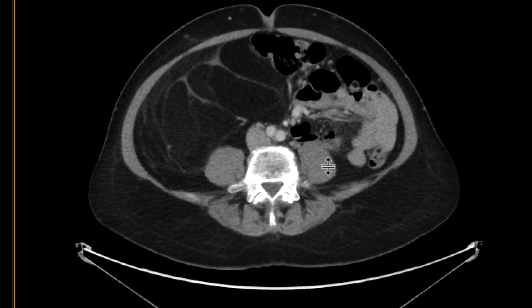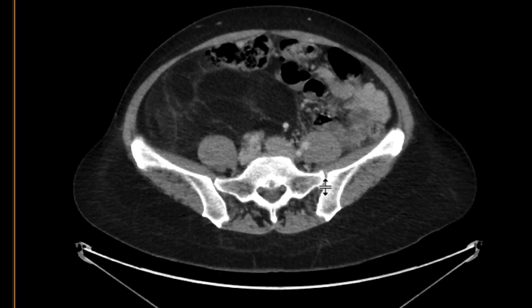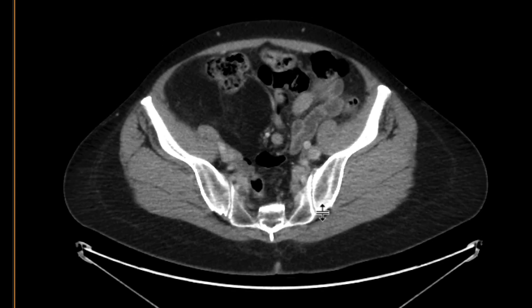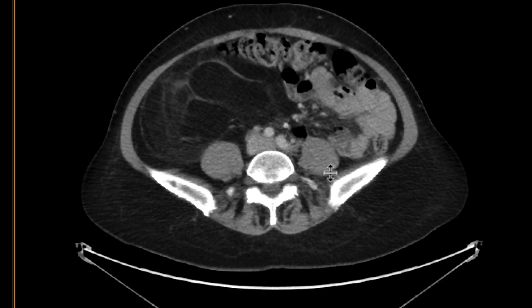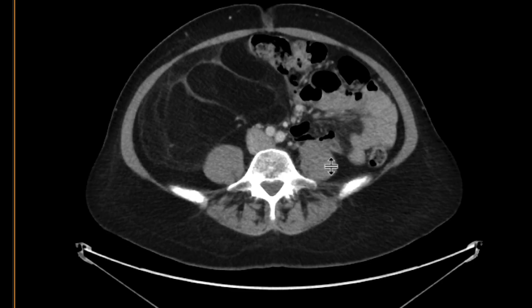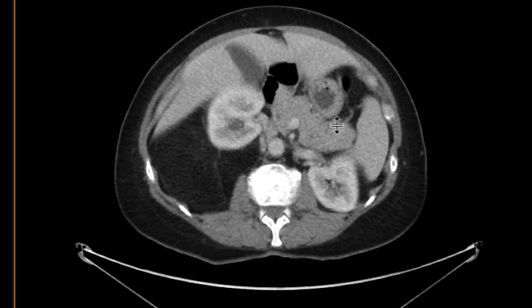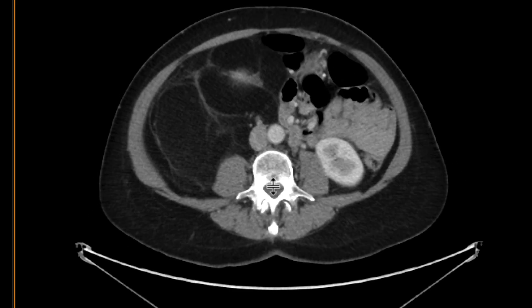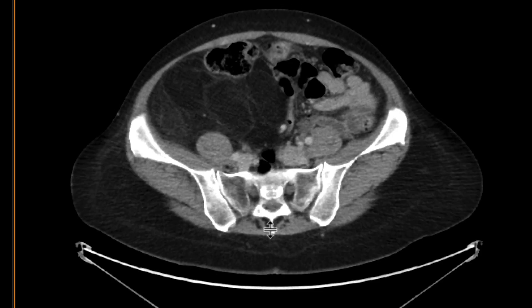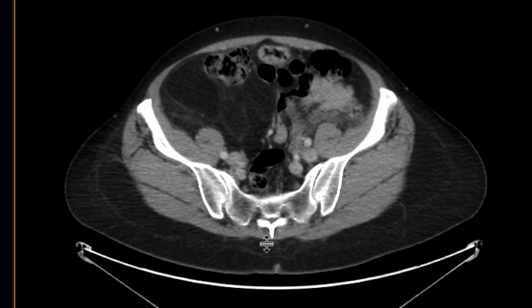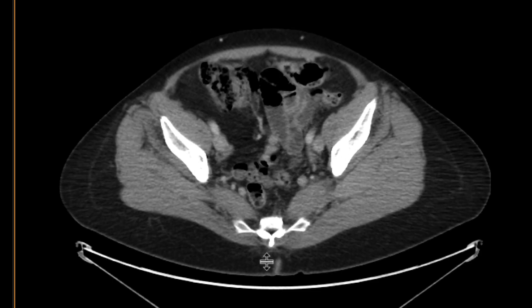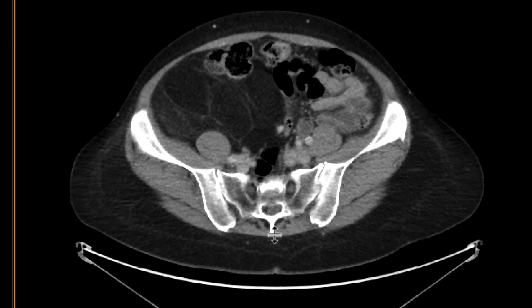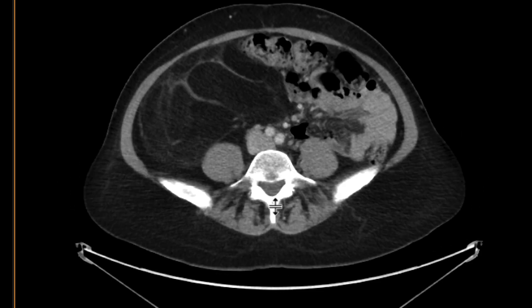Most of this is fat, but there's also heterogeneous septations and some soft tissue associated with it — a soft tissue nodule, as you can see over here. That's really displacing the right kidney anteriorly, going all the way down to the pelvis and displacing some of the bowel loops over there.